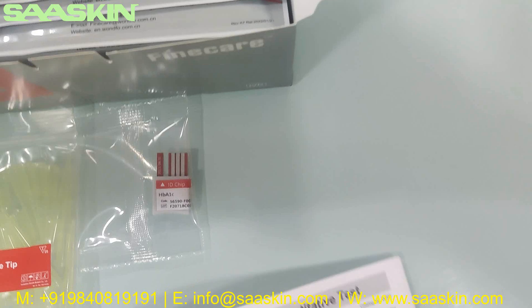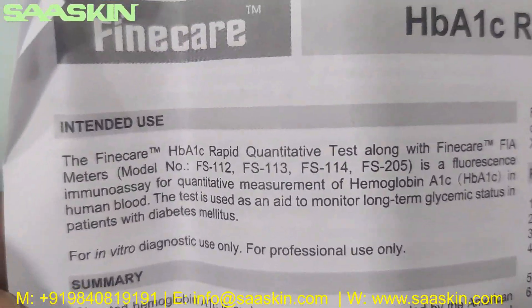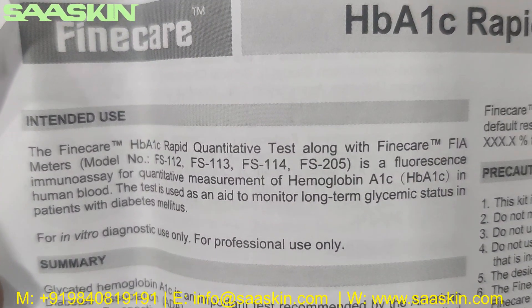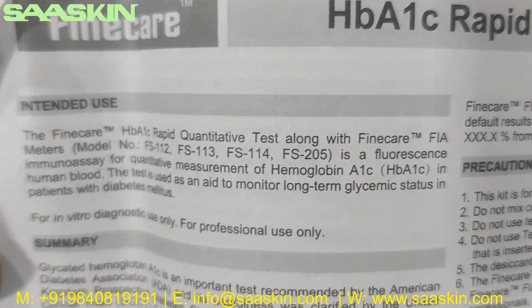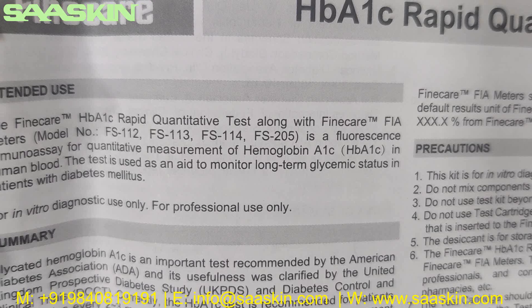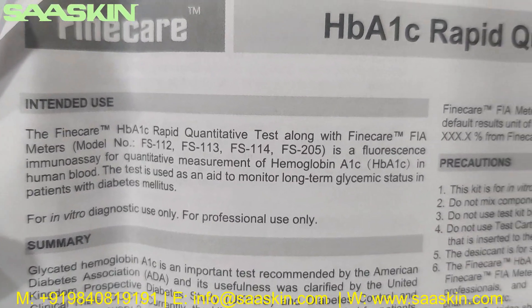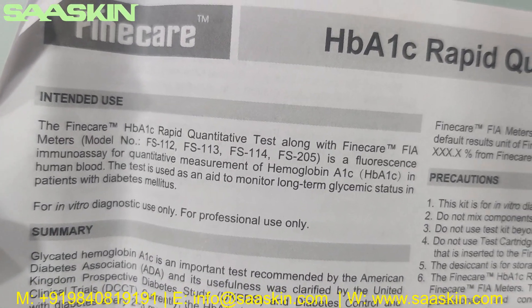And you get an IFU brochure here. There is one more IFU brochure. You can see it says FineCare HbA1c Rapid Quantitative Test along with the FineCare FIA meters. It is a fluorescence immunoassay for quantitative measurement of Hemoglobin A1C in human blood. The test is used as an aid to monitor long-term glycemic status in patients with diabetes, and you get this also along with the kit.